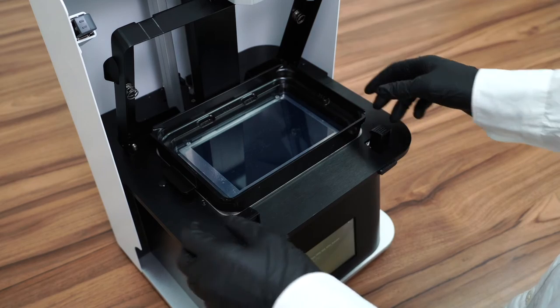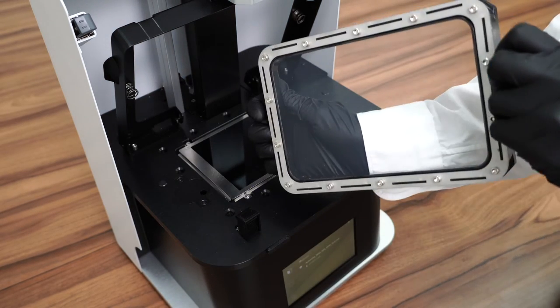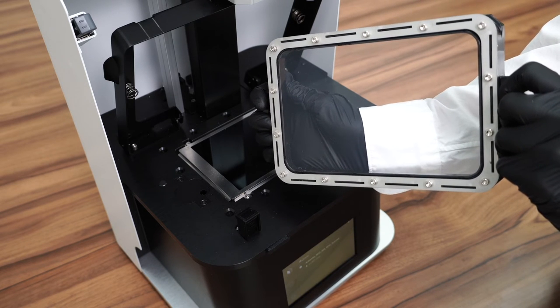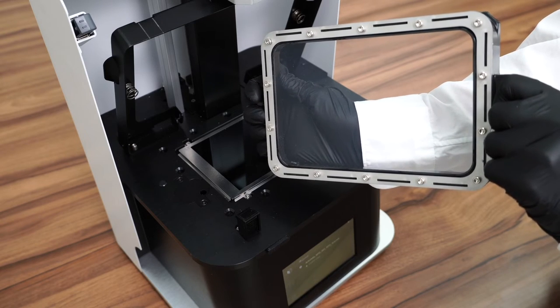As you remove your vat from your Dentique or Sole, you will notice that there are little screws on the back of your vat. These prevent your vat film from getting scratched if you place it on the table.